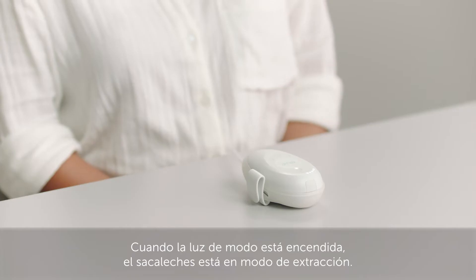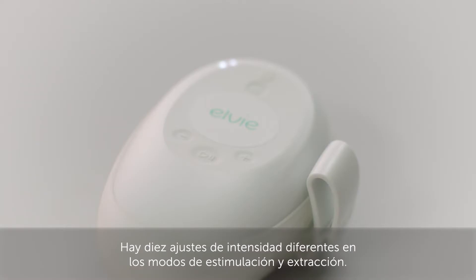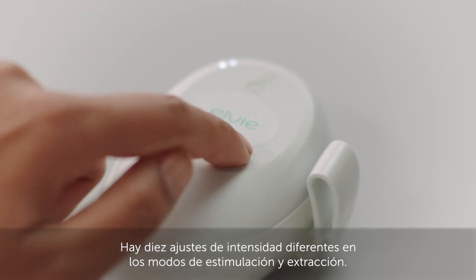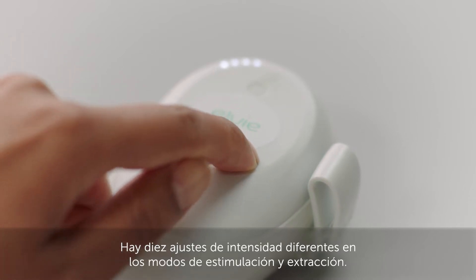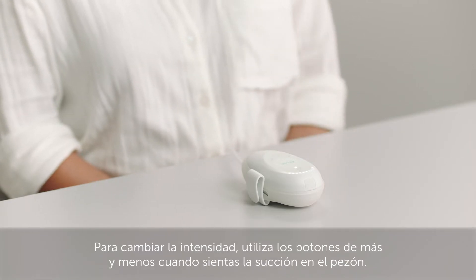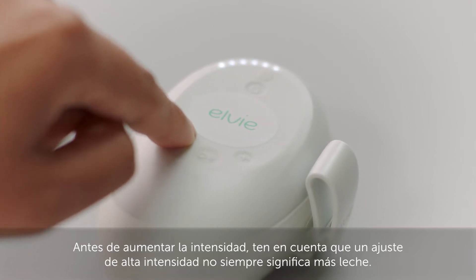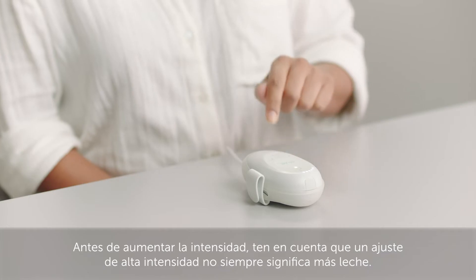When the mode light is on, the pump is in expression mode. There are 10 different intensity settings in both stimulation and expression modes. To change intensity, use the plus and minus buttons when you feel suction on your nipple. Keep in mind that a high intensity setting doesn't always mean more milk.